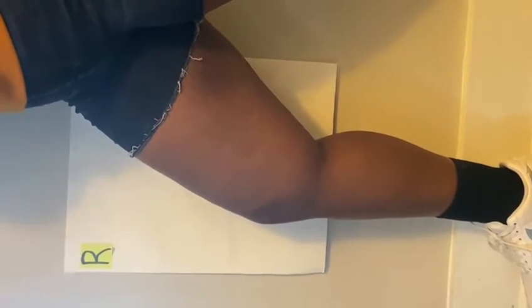For lateral femur, we're gonna have the patient rotate toward the affected side, place the leg on the film receptor plane, and adjust the film so that the lower border is 2 inches below the knee joint, and the center ray will be on the center of the film.